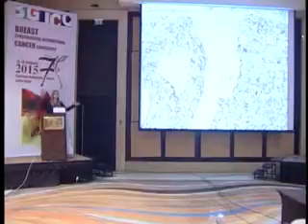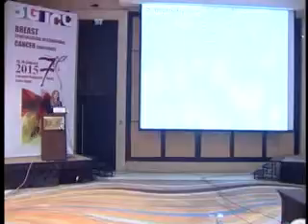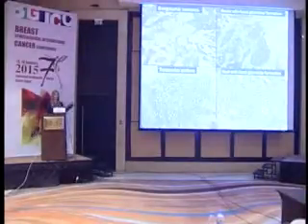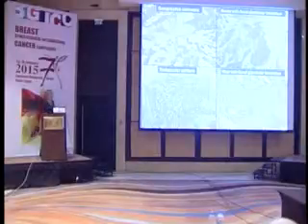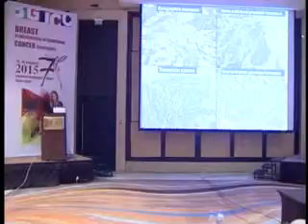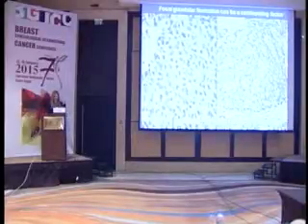And I put a few images. What would I do? Chromogranin? Beautiful. Synaptophysin? What else would I do? CD56. Always. Okay? I didn't put pictures, but you do CD56, P63. You might see geographic tumor necrosis. You would see nests with focal glandular configuration, trabecular pattern, so it's always there.